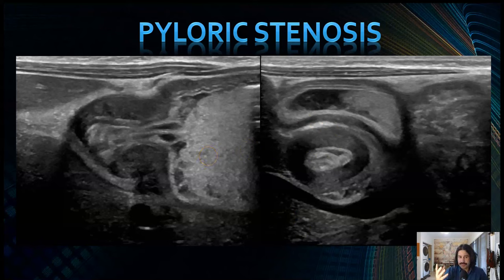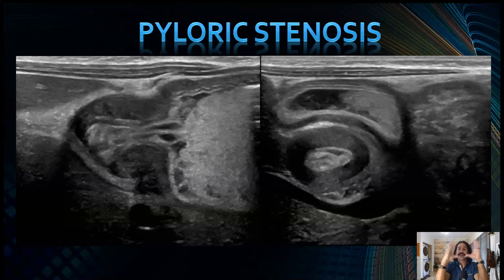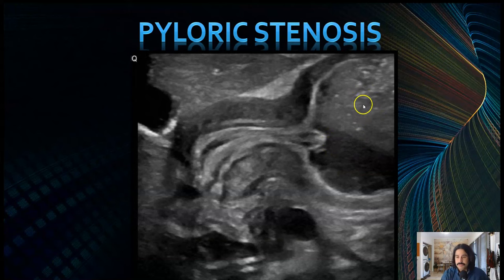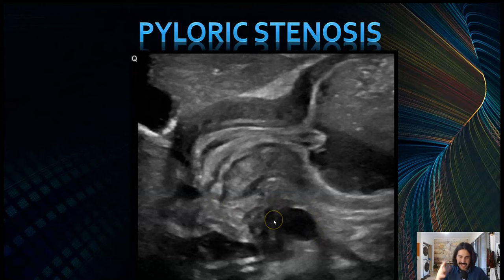Treatment for pyloric stenosis is pyloromyotomy — a small incision in the epigastric region where they cut into the muscle to allow it to expand, and over time the body creates a new serosal surface over that. Here's another case: antral nipple sign, fluid and dense material in the stomach, very thickened muscle. You measure from here to here for length. Some superior mesenteric vein or portosplenic confluence and a little gallbladder are visible as landmarks.